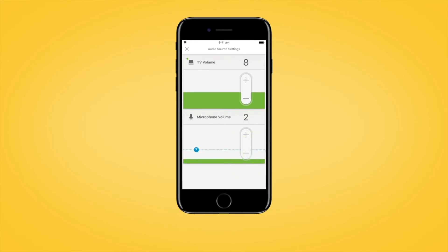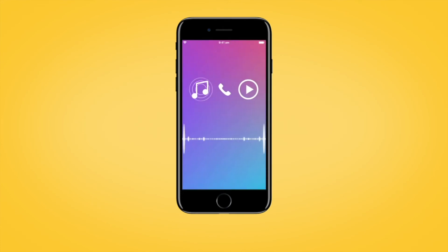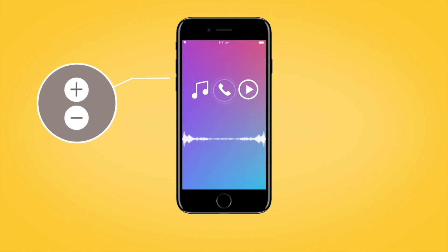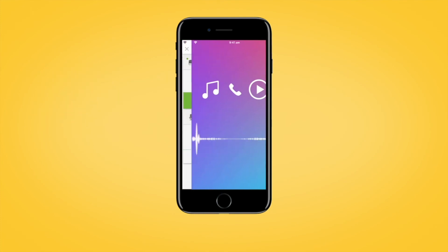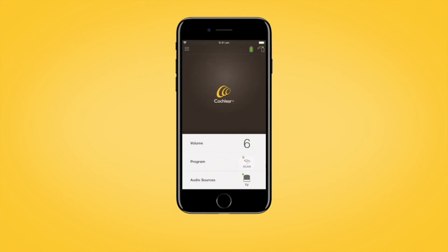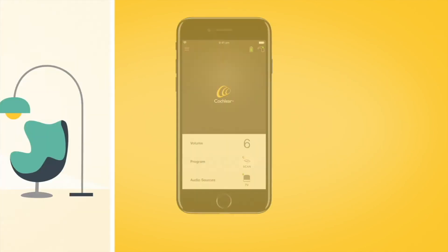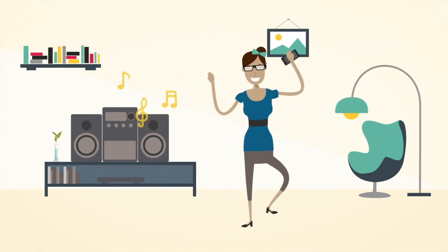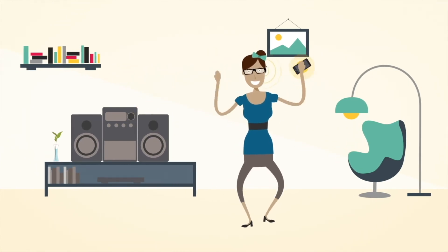If streaming audio from your Apple device, you can change the volume of the streamed audio using the volume buttons on the side of the device. Tap the X in the top left of the iPhone screen to close the audio sources settings and return to the Nucleus Smart App home screen.